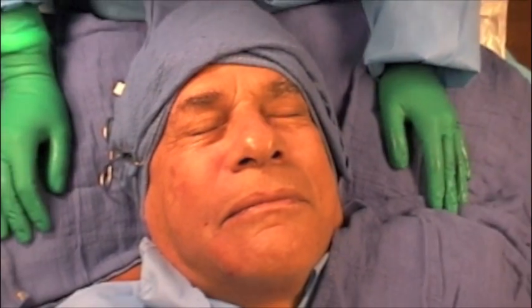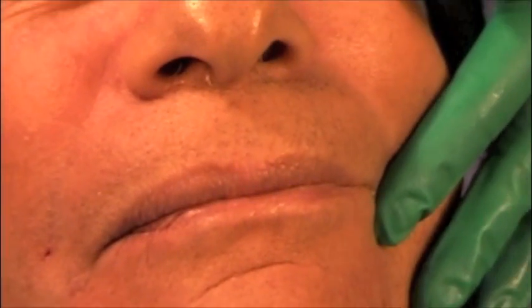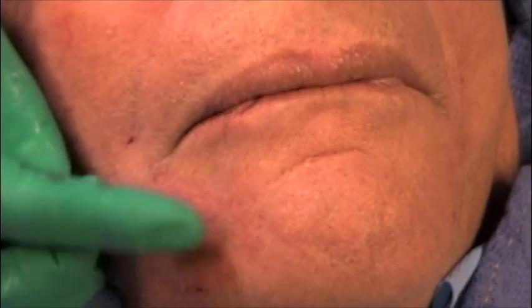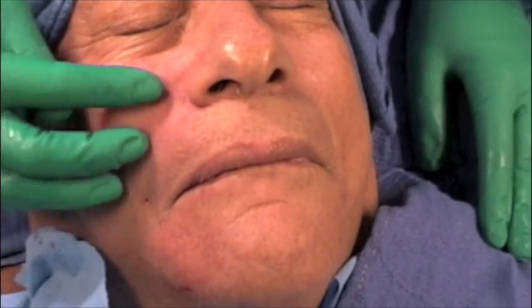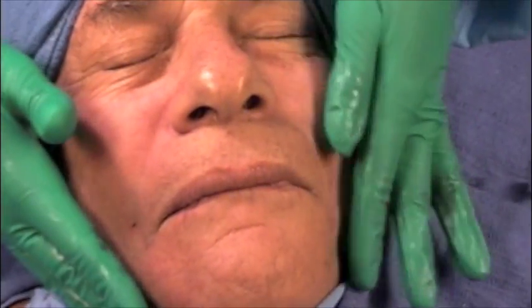Phil wanted to have some fat transferred to his nasolabial fold and his marionette line here. So what we did was we put a little bit of anesthetic here, where you can see that white area, and a tiny bit down here, and we infused about 3 cc's of fat into these regions to help restore and revolumize these lines. You can see on this side we haven't done the procedure yet, and the difference between this side and this side.